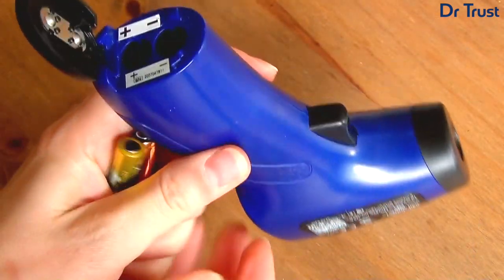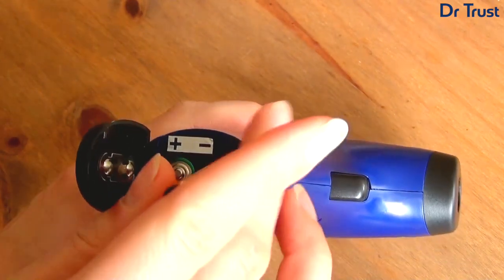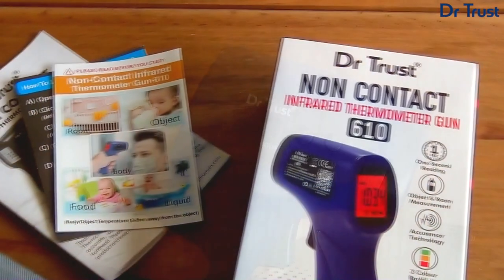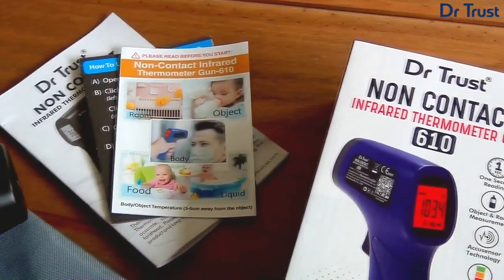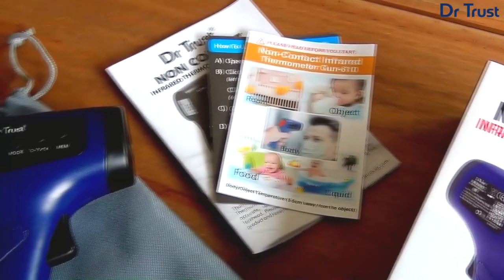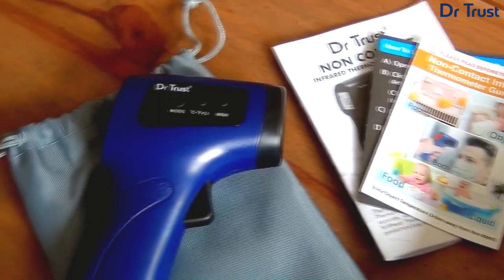This unique device requires just two AAA batteries and measures temperatures in one second with the simple click of a button. Ideal for use at home or while travelling, at medical facilities or even tracking public infections, this quick and accurate thermometer is hygienic, easy to use and reliable.